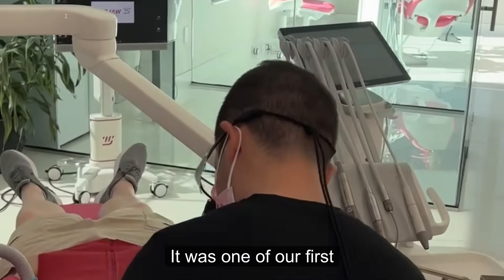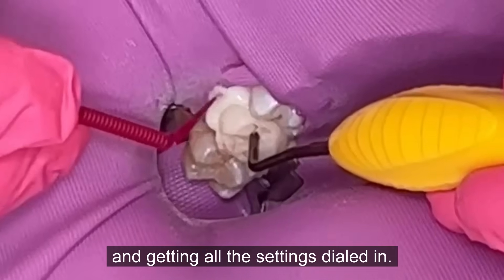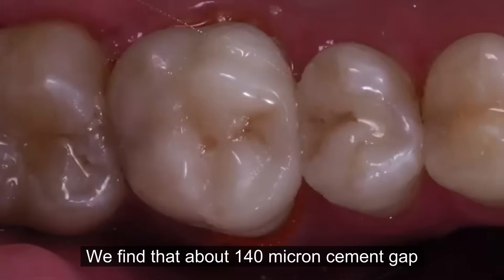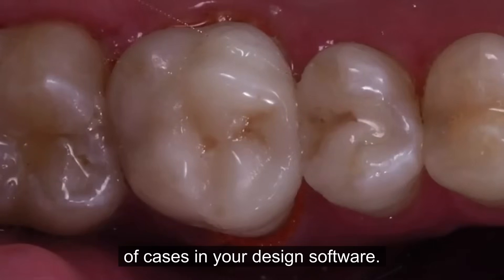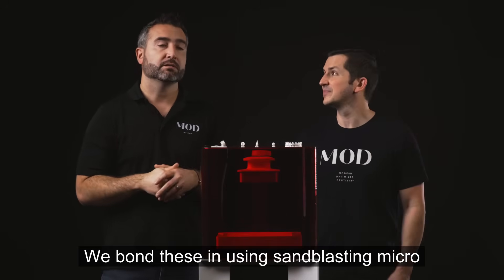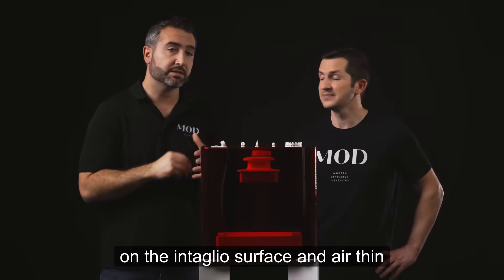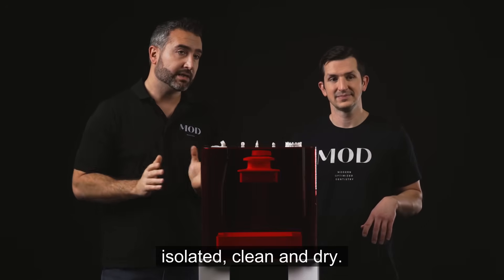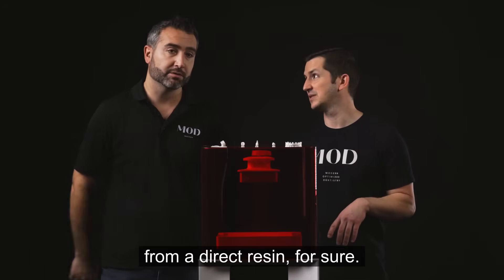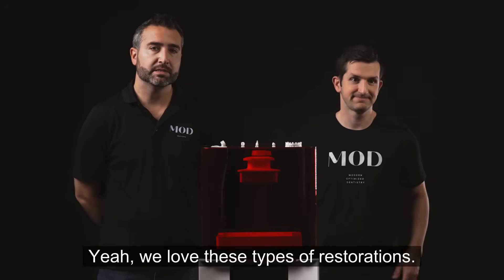It was one of our first ceramic crown cases, and it's all about the digital design and getting all the settings dialed in so these just drop right in. We find that about a 140 micron cement gap is perfect for these types of cases in your design software, to really make that fit slide right in. We bond these using sandblasting and micro-abrasion, and we use adhesive on the intaglio surface and air-thin that, making sure everything's isolated, clean, and dry. These are just a huge upgrade from direct resin — we know it's going to wear better and the aesthetics just blend right in.